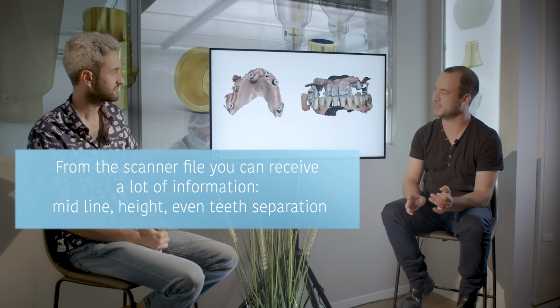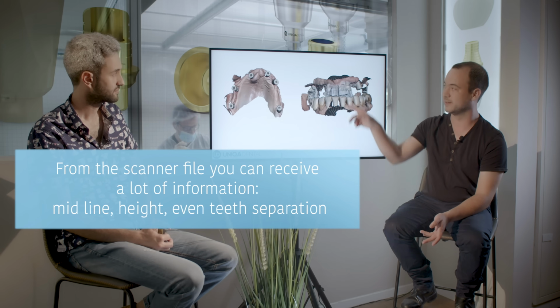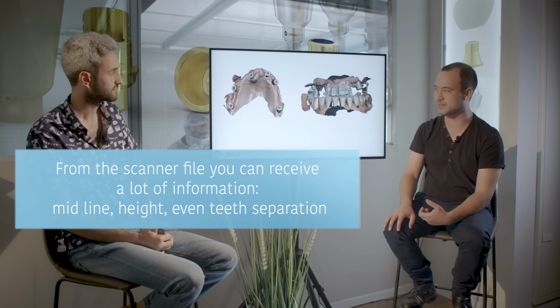What other information can you extract from this type of scanning? From this type of scanning, you can extract any type of information you want. Because if you want the midline, you can just mark it and then scan it. You'll have the midline, like you see here. If you want to know where the canine is supposed to be, you can add a little bit of composite and mark. You know the height because the upper and lower jaw are in occlusion. You can have any information you want. You can even mark the upper teeth, how you think they need to be separated in the end.